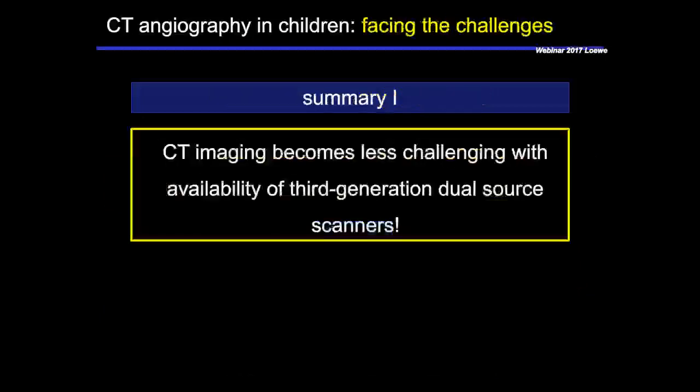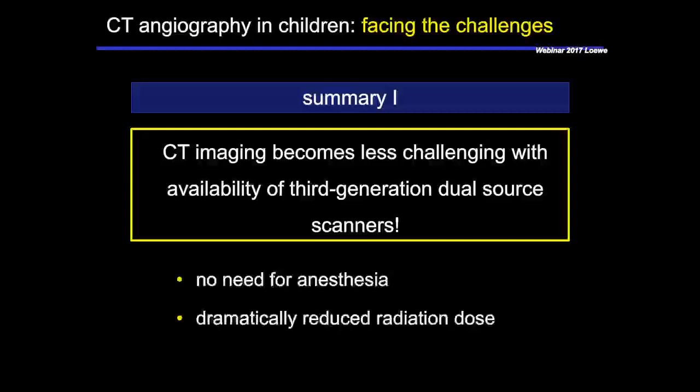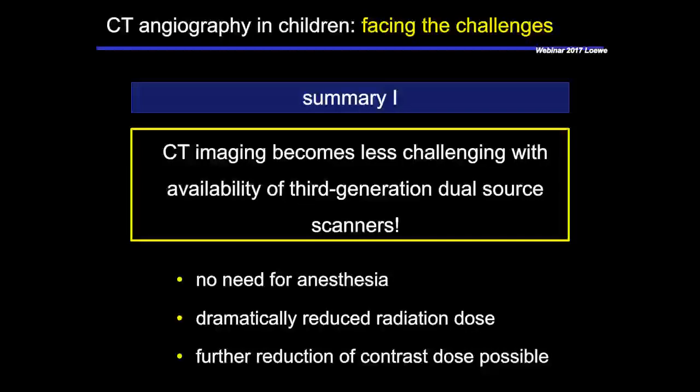CT imaging becomes less challenging with the availability of the third generation dual source scanners. We don't have any need for anesthesia. The radiation dose can be dramatically reduced, and even the contrast dose can be further reduced in the small children as well.